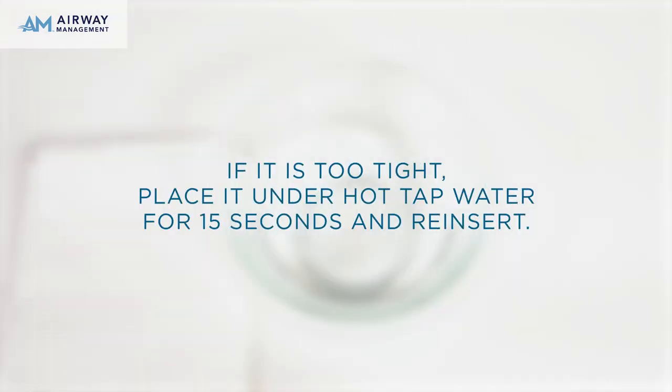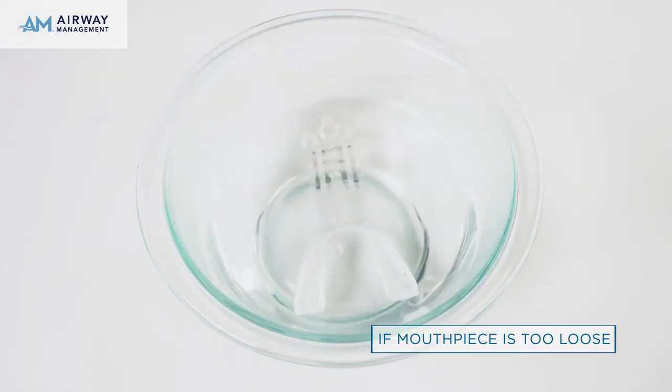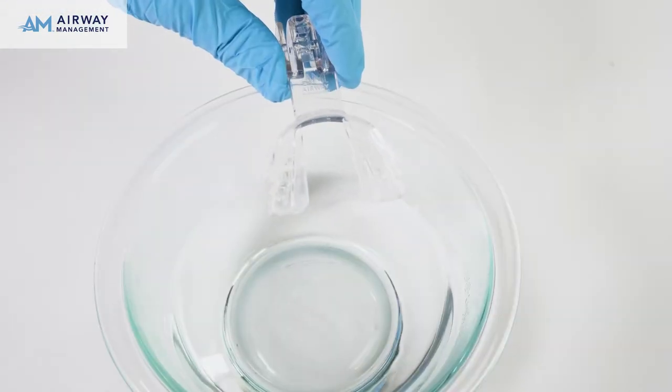If it is too tight, place it under hot tap water for 15 seconds and reinsert. If it remains tight, use your thumbs to widen the mouthpiece. If it is too loose, repeat the fitting process using boiled water. The mouthpiece will return to its original shape when placed in boiling water, allowing it to be refit as many times as necessary.